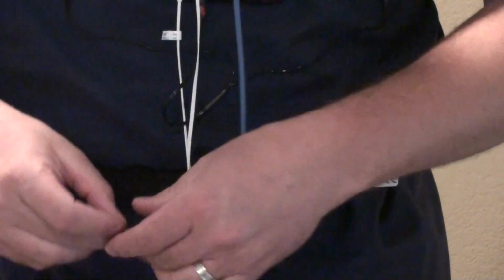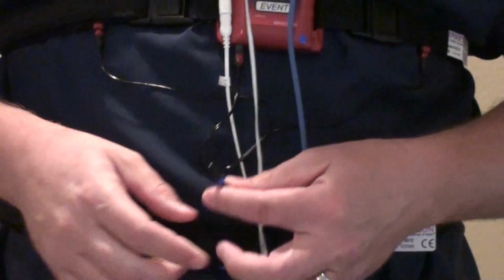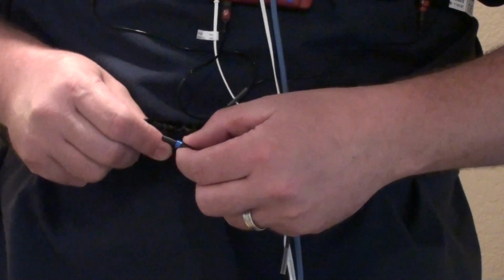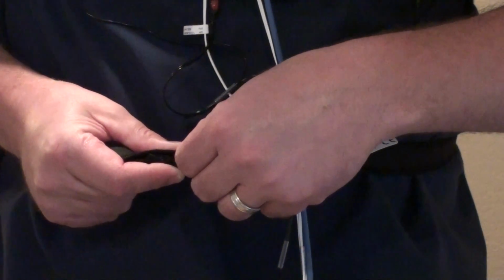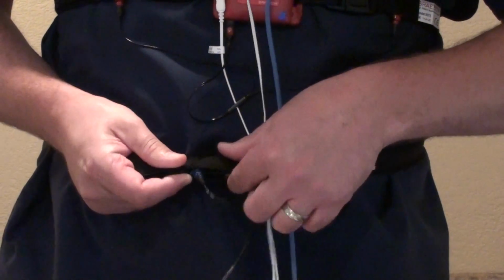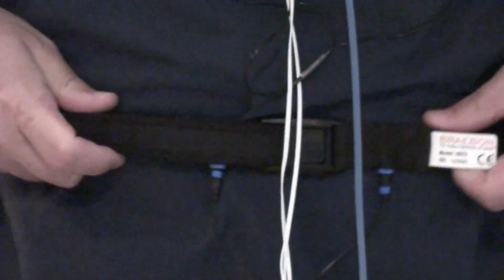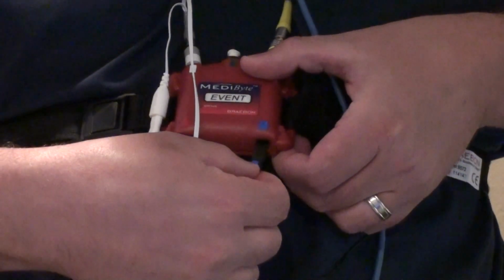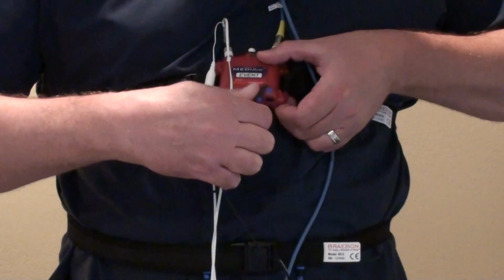Take the remaining black Y-shaped cable and plug one safety pin connector marked with blue tape into the right socket located on the belt. Plug the keyhole connector into the black keyhole input on the bottom left of the MediByte, labeled abdomen and marked with blue tape.